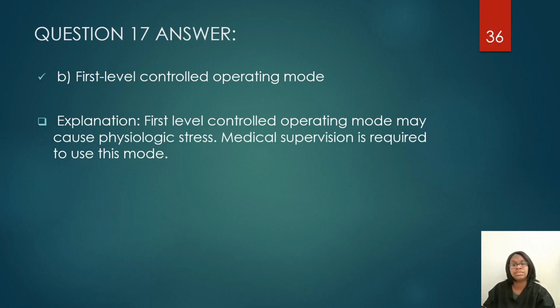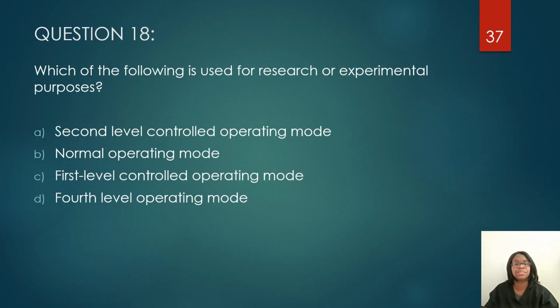When you use this, medical supervision is required just to make sure that they are not under any type of stress. And if they are, you should always have the panic ball regardless if you're using this mode or normal mode. I always use normal mode, but they should always have the panic ball or the call ball in their hands because sometimes they think you can hear them if they're saying something. So I always just give them the emergency ball to squeeze.